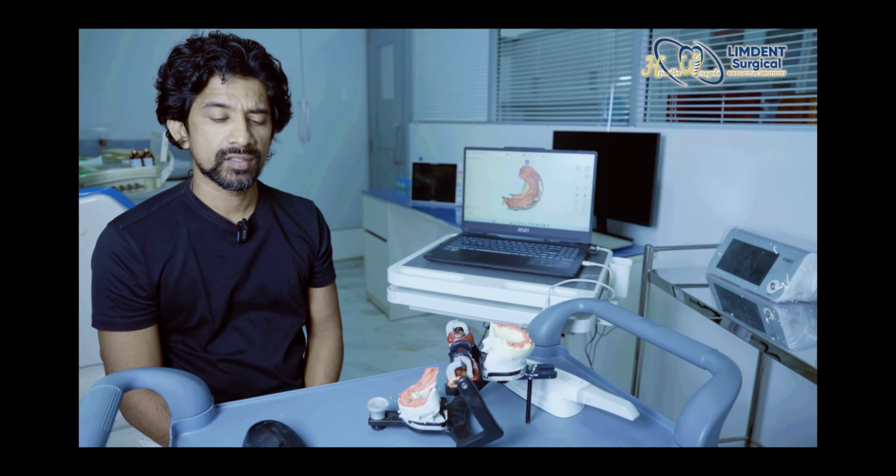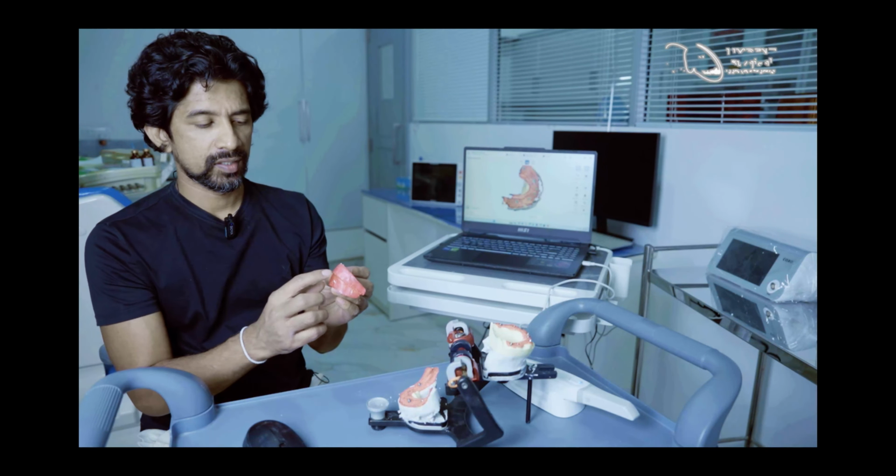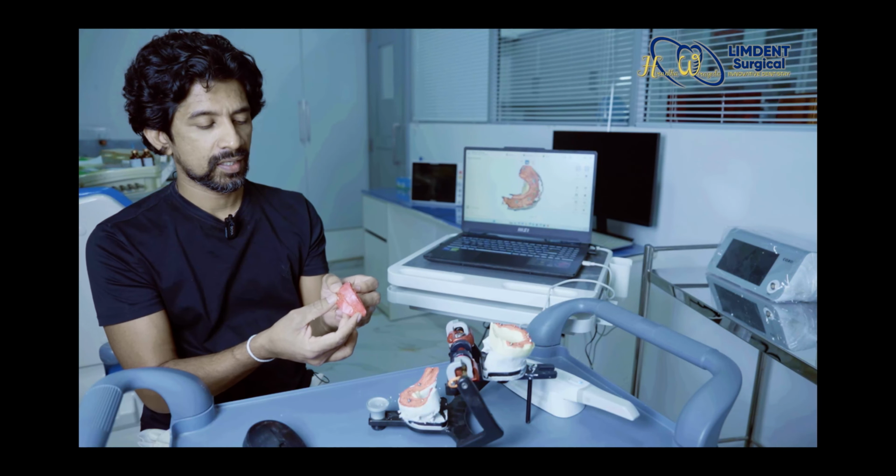This is the most important part that we'll be needing for the digital dentistry involvement in these particular cases of full mouth reconstruction. As you can see, this is a bite, the upper and lower bite rims are sealed. You can see the midline, the occlusal plane, and the canines.